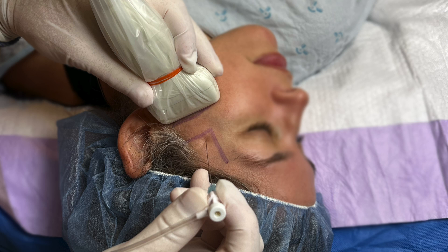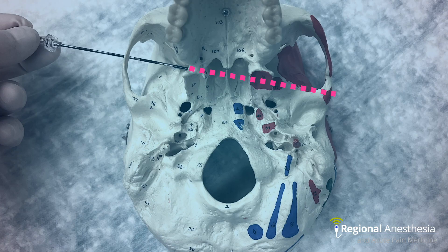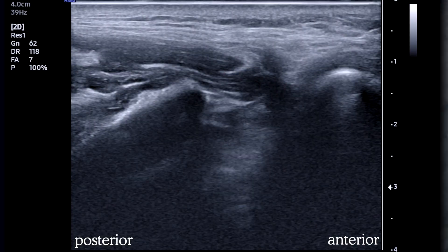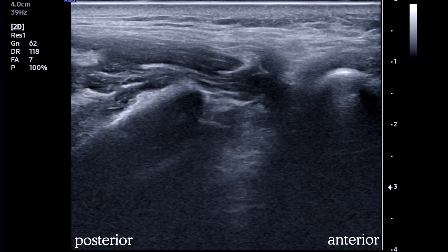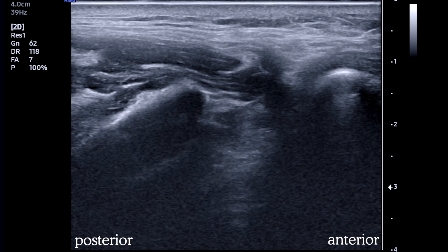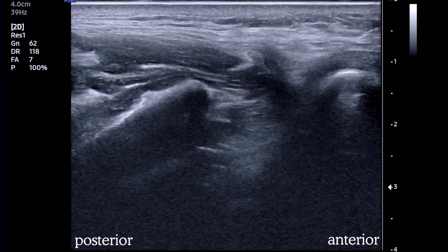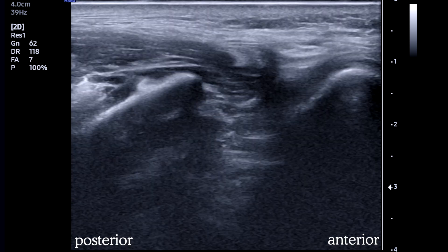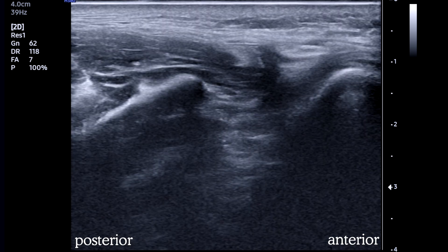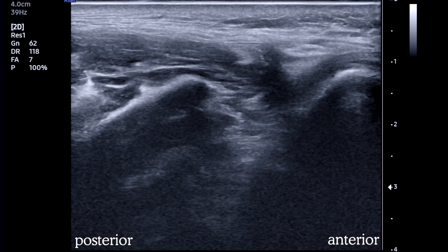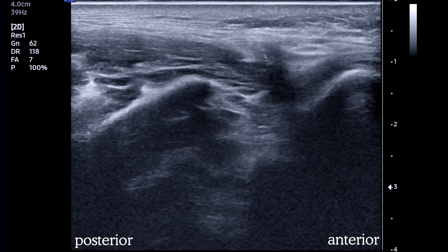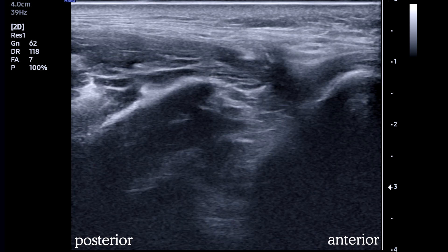Once we have our image, we'll place our needle at a point just above the zygoma and posterior to the orbital rim, and advance slowly into the infratemporal fossa. Note that the probe is tilted slightly cranially and the needle is directed slightly caudally — imagine the beam and needle meeting at about four centimeters into the tissues. A good directional landmark is to aim the needle for the tragus of the contralateral ear. You'll see tissue motion as you advance; small squirts of saline can help you hydro-locate. Once you get to about three to four centimeters, or just above the lateral pterygoid plate, aspirate and inject — five mils of local anesthetic is all that's required to flood the deep infratemporal fossa and soak the SPG.